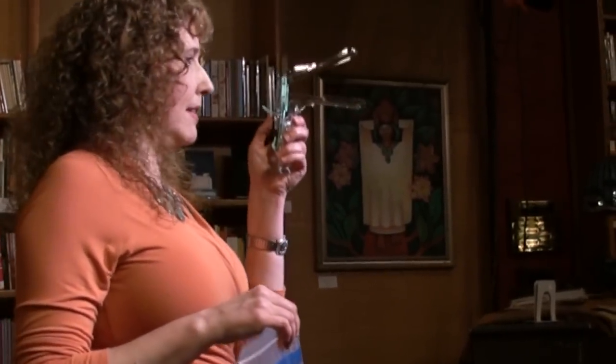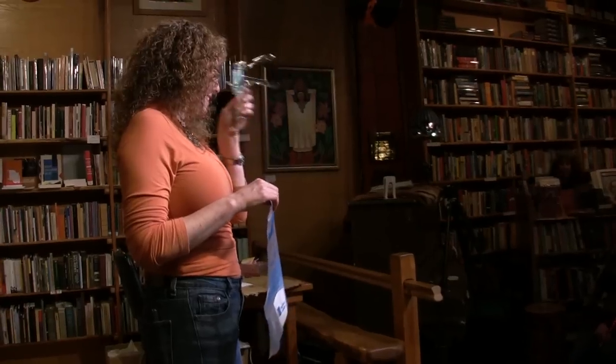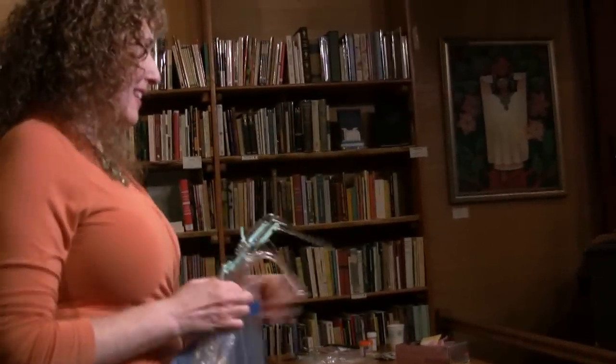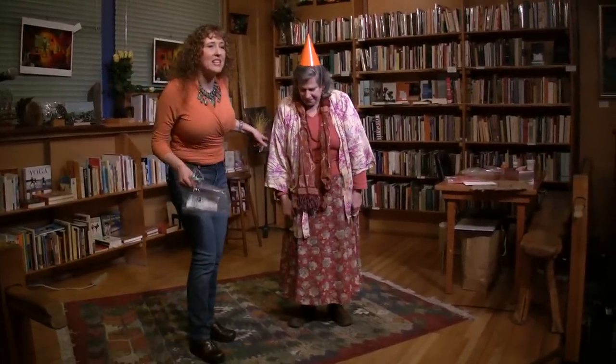So here's what happens. I need a model. Show up in a skirt. Then you don't have to get in the weird drapey thing that sometimes is paper in some offices. Then just lay there and pull your skirt up.